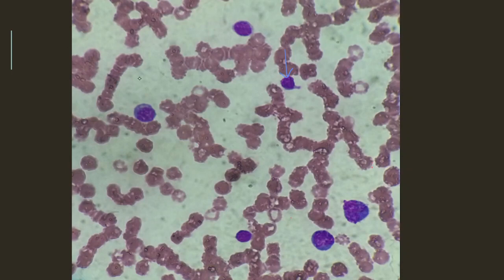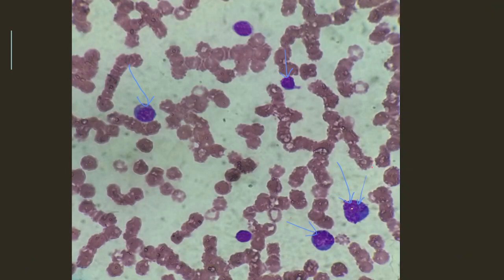And also here we can see these numerous lymphocytes, which are larger than the mature lymphocyte. The nucleus, compared to the mature lymphocyte, has some whitish spaces in it, so the nucleus is a little more open than the normal mature lymphocyte. And the cytoplasm is deeply basophilic.